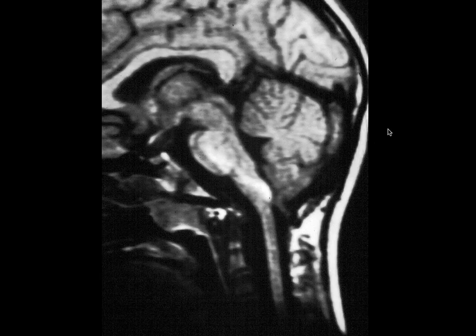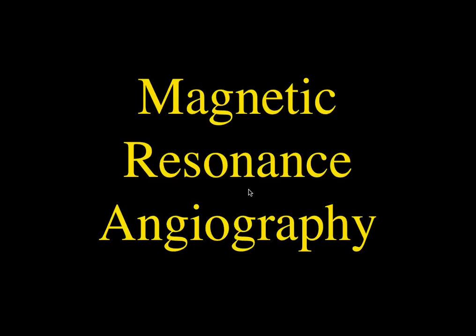Here's an example. We can see CSF flow anterior to the pons that's at an oblique angle. Because the readout gradient is up and down, it's actually displacing the signal intensity that should be the CSF into the brain stem itself. So you can occasionally see that.